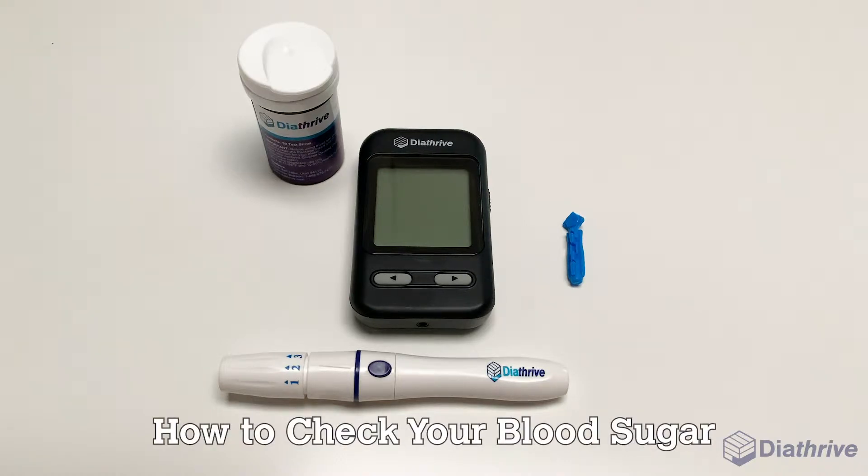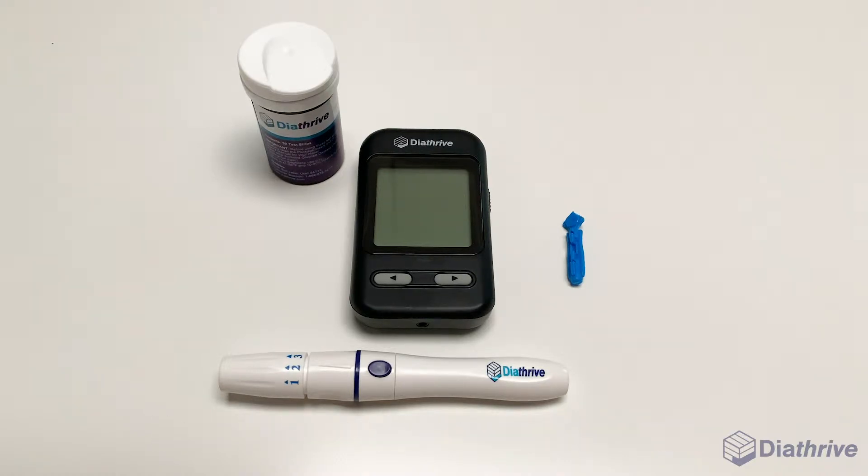Checking your blood sugar is the best way to find out what affects your blood sugar. The process has a few steps that are simple once you do it a couple of times.